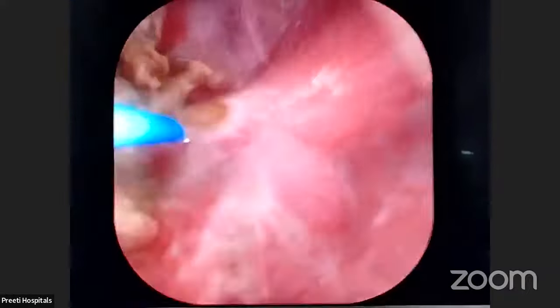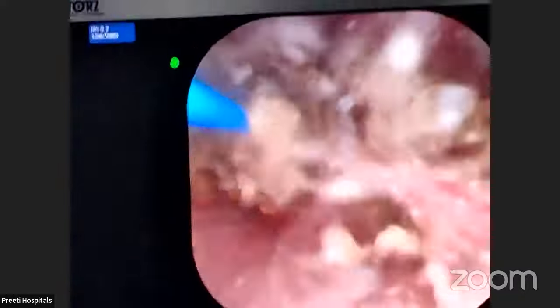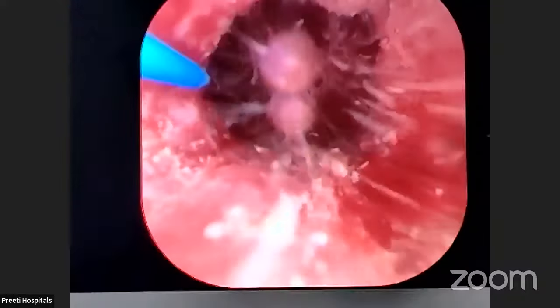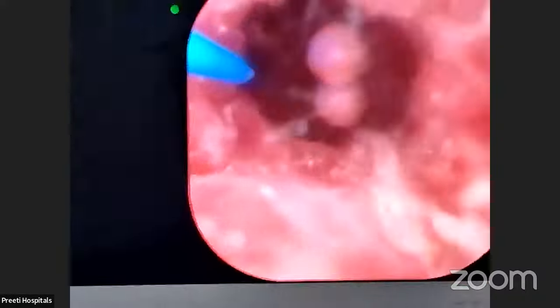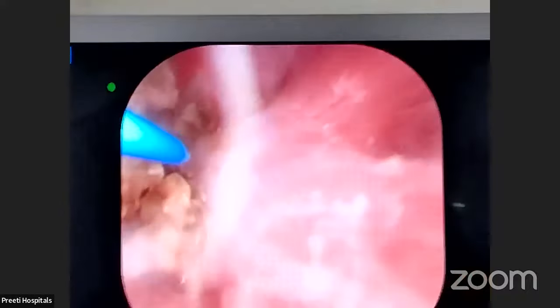see, now again start. So the number of powder particles in the center of the calyx are very few. That's why you are better utilizing your laser energy in this process. I hope you understand what I'm telling. If powder is there, unnecessarily powder will be beating. Now again, suck, see what is wrong, flush, suck, no pressure will rise, see everything is sucked out.